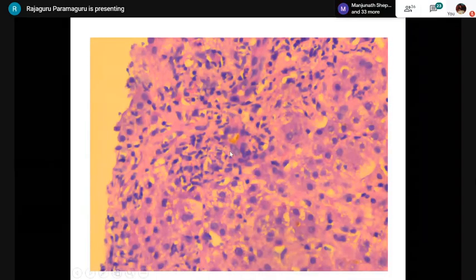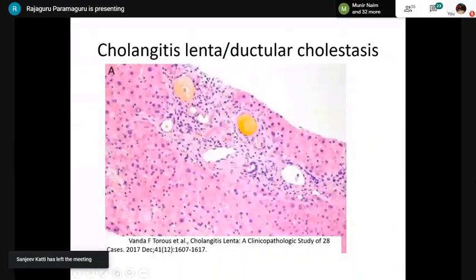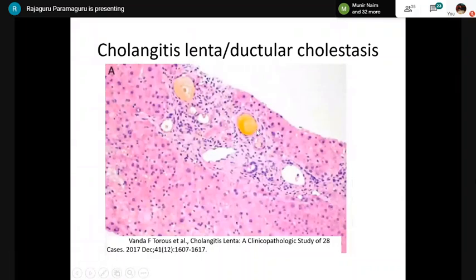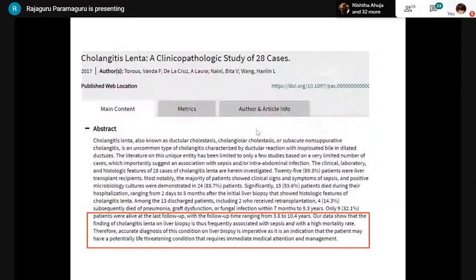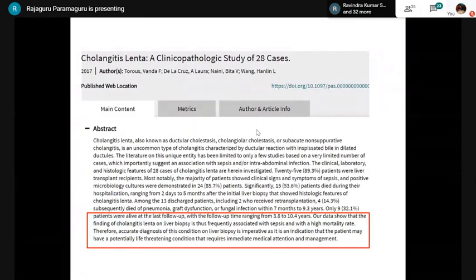Cholangiole (ductular) cholestasis — bile is seen within the ductular structure lumen. This is called cholangitis lenta or ductular cholestasis. It has its own significance: the presence of bile within ductular structures indicates that the patient may have sepsis. A study performed in 28 cases found that cholangitis lenta on liver biopsy was associated with sepsis and higher mortality.